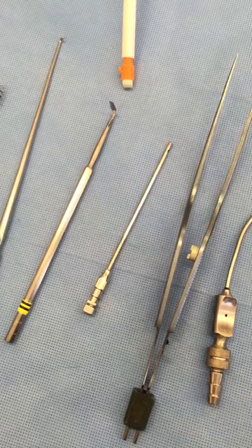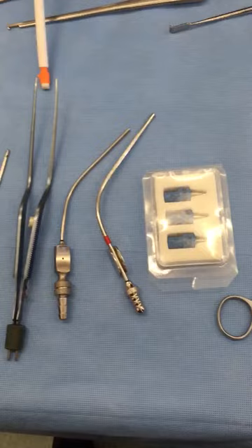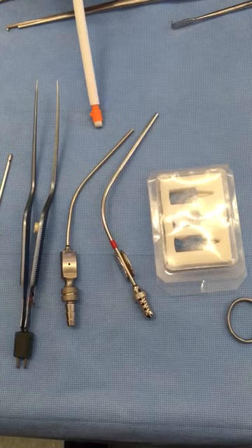Ventriculostomy Brain Needle. Titanium Bayonet Forceps. Fraser Suction. Adson Suction.